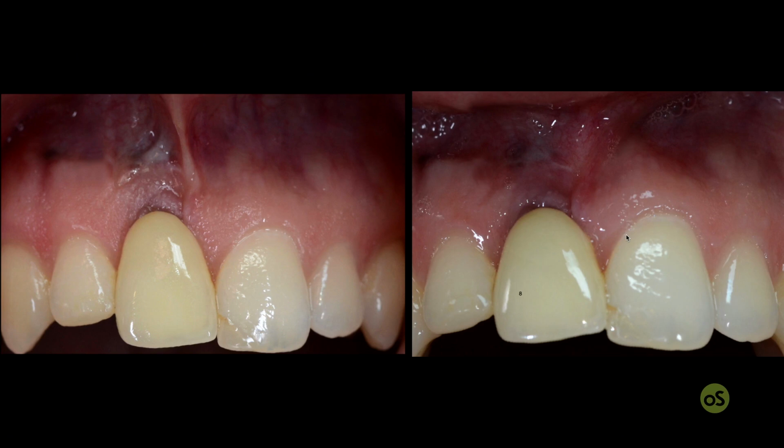So this is just to tell you that a free gingival graft can never be the right treatment to cover the soft tissue dehiscence around the implant, because there is no blood supply when you apply this graft on the crown and on the implant surface or abutment surface or whatever it is.